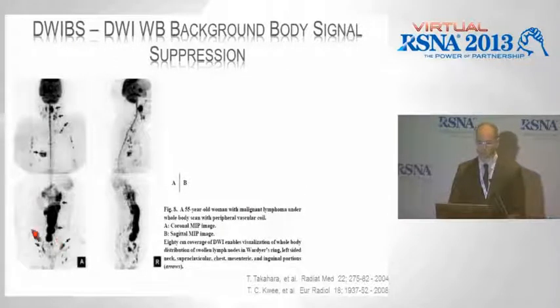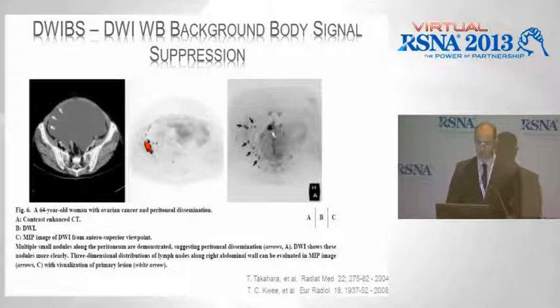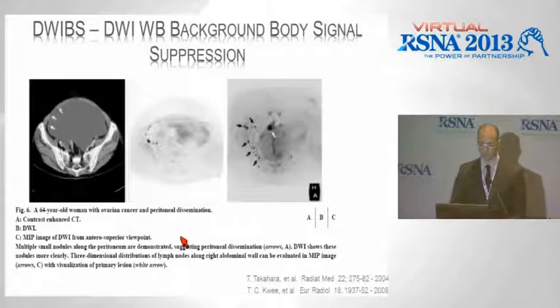They also demonstrated that finding the extent of disease in this patient with lymphoma was quite easy with this PET-like experience. And you could also identify really small lesions. I mean, they showed that they could identify peritoneal implants from a patient with ovarian cancer, which are also seen on a PET-CT, but these lesions are always difficult to find.